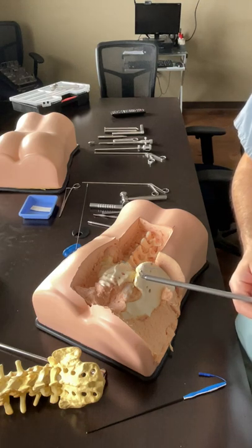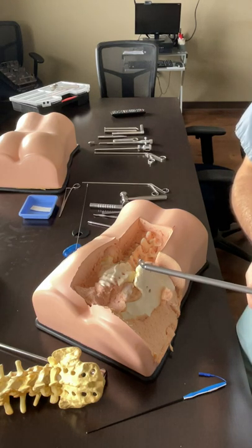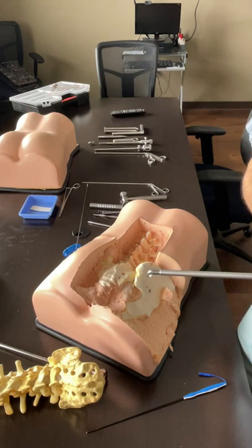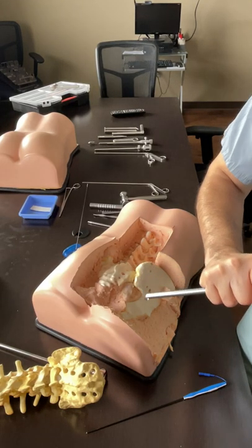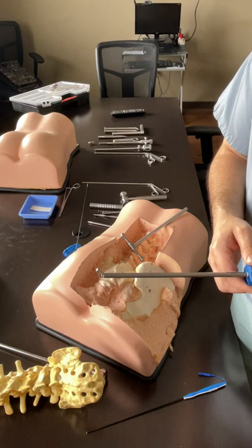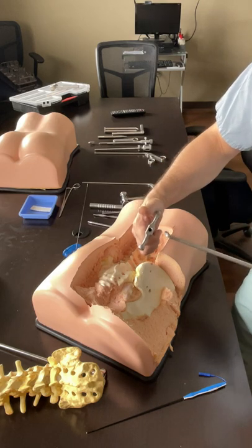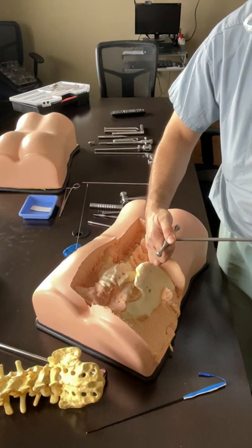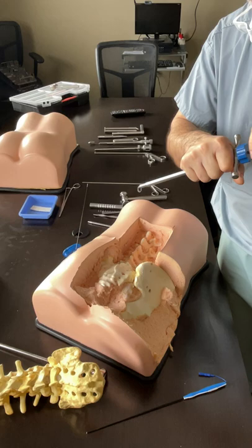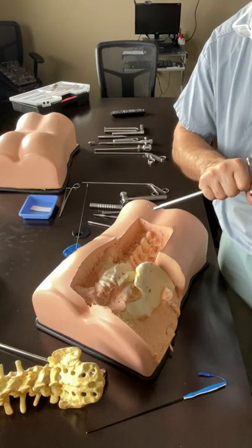I'm pretty aggressive with this and go around. Once I'm done with one side - another perk - I pull it back, turn 180 degrees, come out again and it goes the other way, doing the other side as well. If it locks, I use another one, but it's also possible to use it without pulling it back - I call this a rescue technique. I put it in, look at the direction, push it in, turn the direction - it comes out. You have to control this very clearly, but this is the rescue technique.